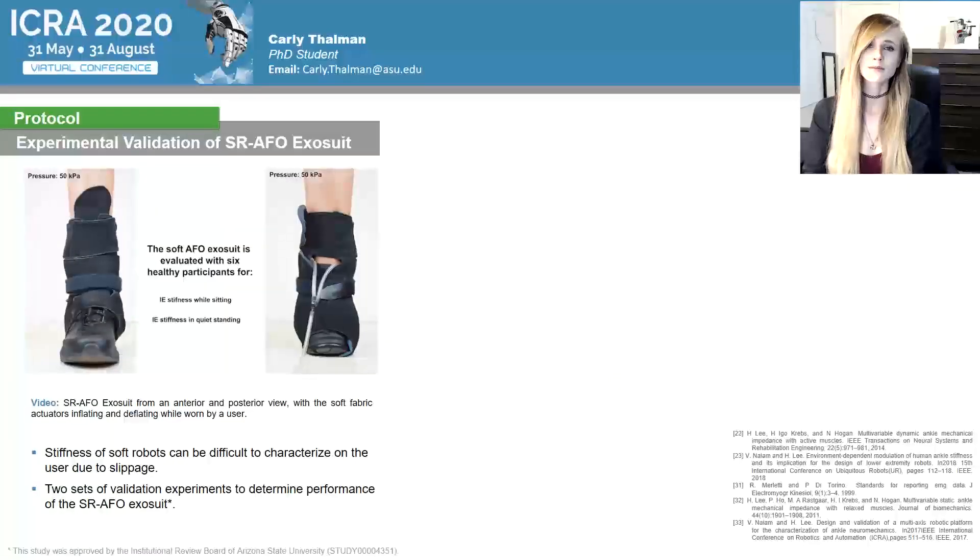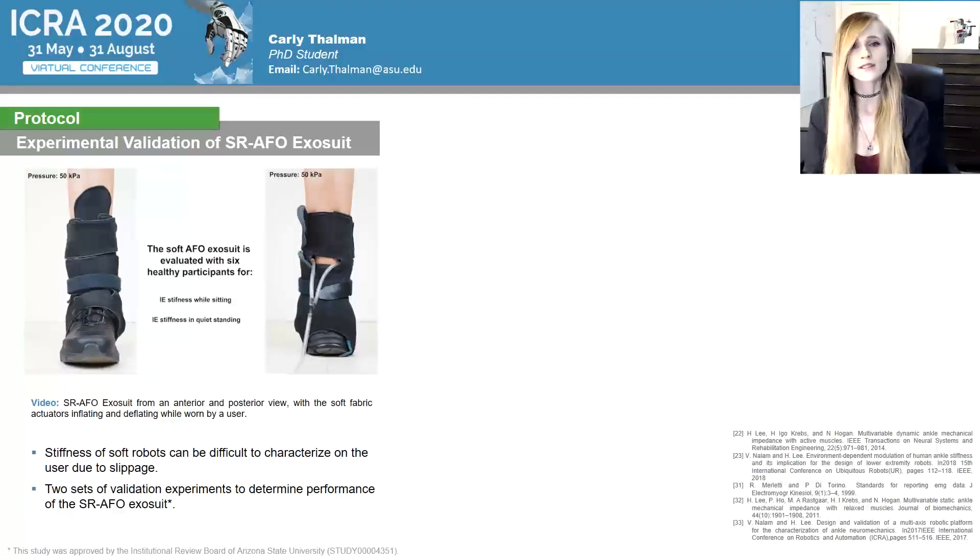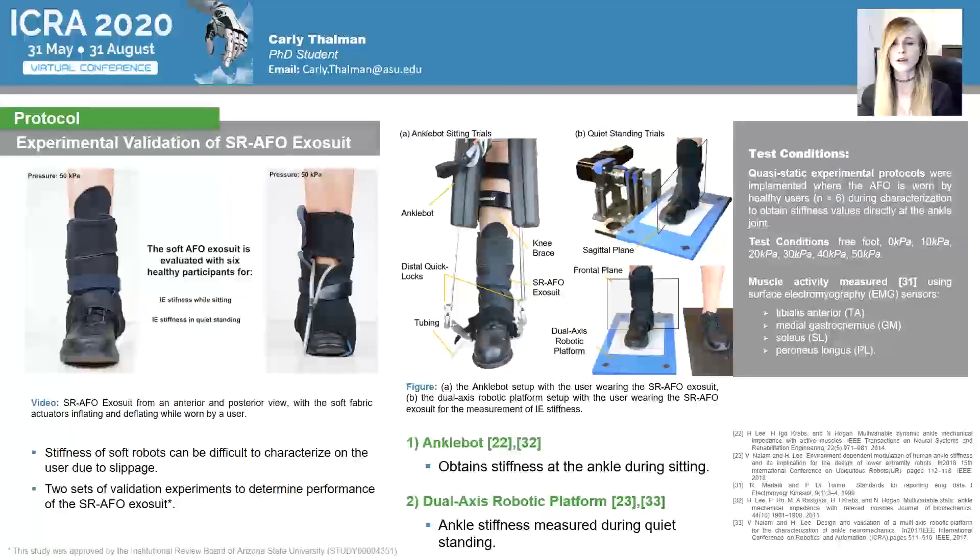Stiffness characteristics of soft robots can be difficult to characterize when on the user, due to slippage or the compliance of the materials against the user and their skin. To address this challenge, a robotic approach was taken using two sets of validation experiments to determine the most accurate results of the performance of the SR-AFO exosuit. A quasi-static experimental protocol was implemented where the AFO was worn by the user during characterization to obtain stiffness values directly at the ankle joint, completed for six healthy participants. The test conditions evaluated were: free foot with no exosuit, zero kPa where the exosuit was donned but passive, and then five increments of 10 kPa up to 50 kPa. Muscle activity was also recorded throughout these trials. The two trials were completed using two different robotic platforms: the Anklebot and a dual-axis robotic platform.